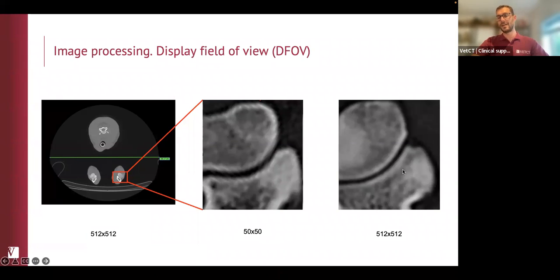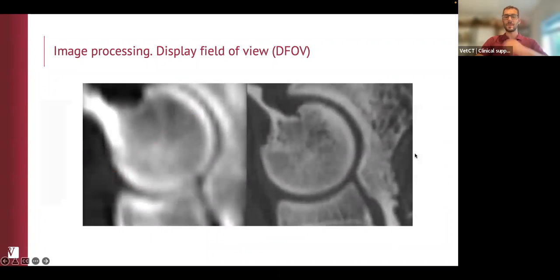And we can see that that's just a little bit of trabecular bone that extends there, which is completely normal, okay? And this lack of resolution extends into the MPRs. It's the same dog with a different field of view. And if you try to look at congruity, I don't know, because I don't even see the joint space, like the humerus is fused to the radius here. If you repeat that and do things properly, all of a sudden you can see the joint spaces beautifully, okay? So there's not much point in using submillimetric slices if then you use a massive field of view.